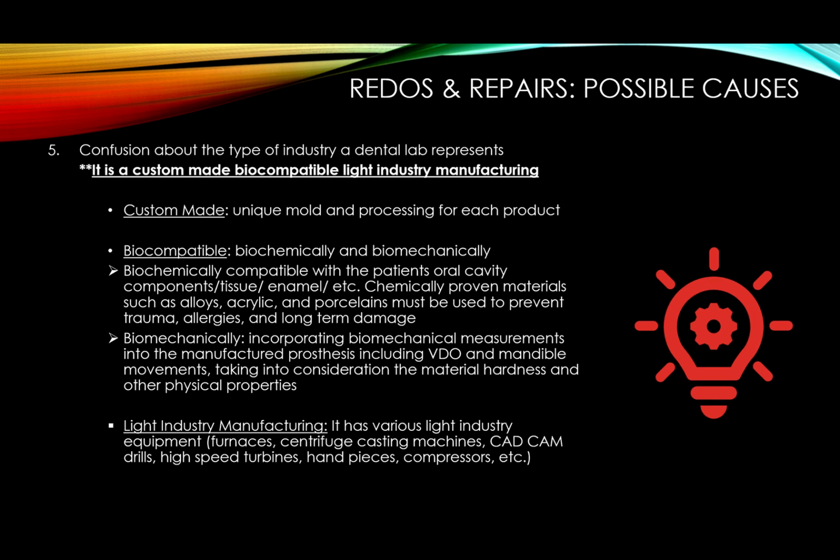It's custom made. With anything custom made, the redos and repairs are higher, because you have to pay good attention to fine details, right? So just by being custom-made manufacturing, the risk of redos and repairs is higher, but we should try to control it as much as possible. We will discuss that. Then biocompatible, you're limited.